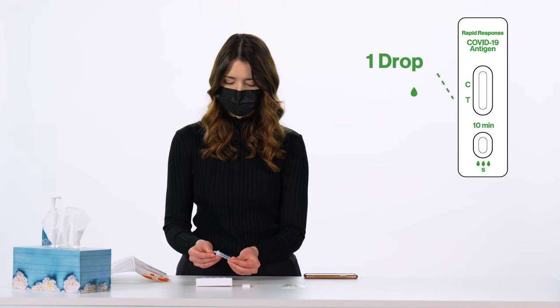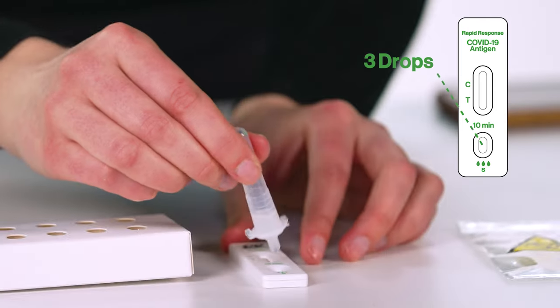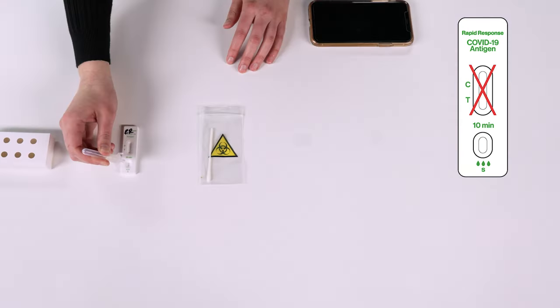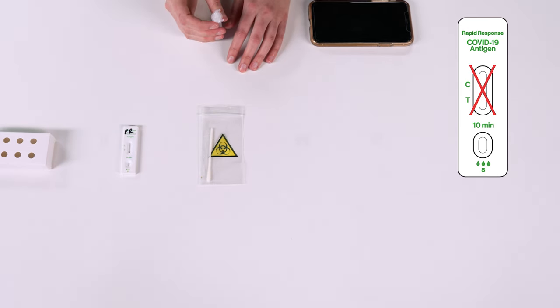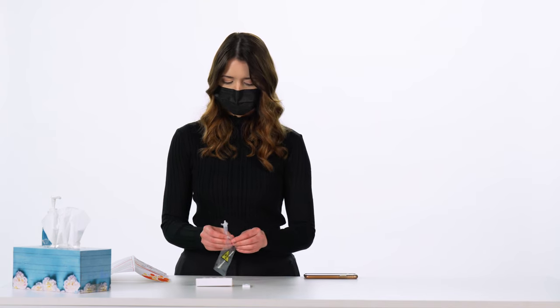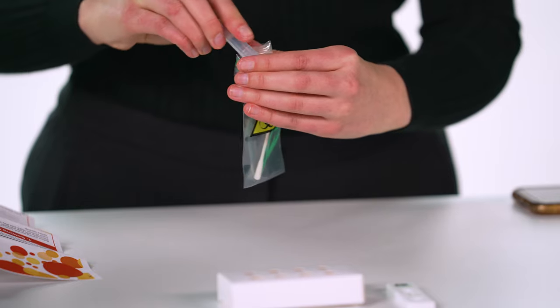Secure the nozzle tightly onto the top of the tube. Invert the tube and add three drops of the sample to the sample well S at the bottom of the test cassette by gently squeezing the tube. Do not add the sample to the results window, which is the longer window above the sample well. Make sure that the liquid and not air bubbles come out of the tube. Once you have added the three drops, dispose of the extraction tube in the plastic waste bag provided.